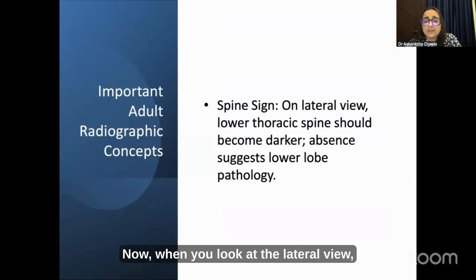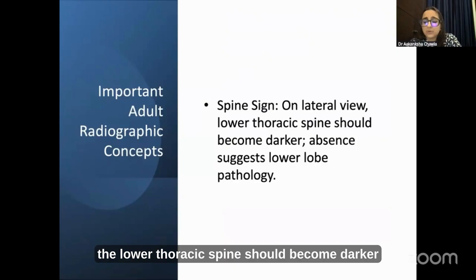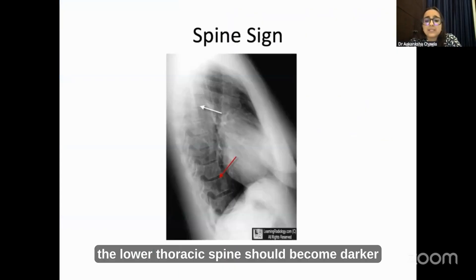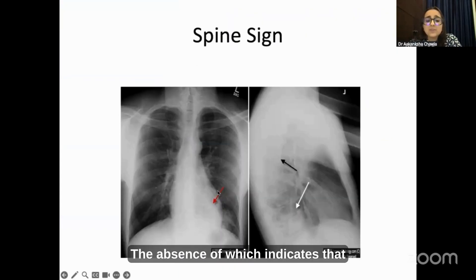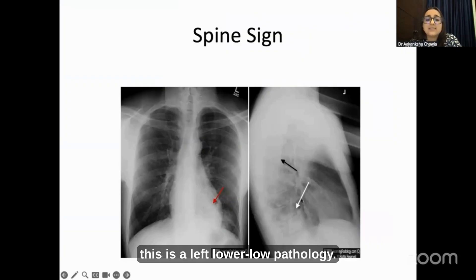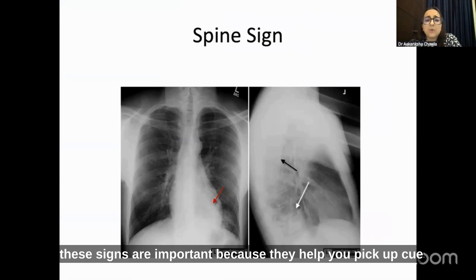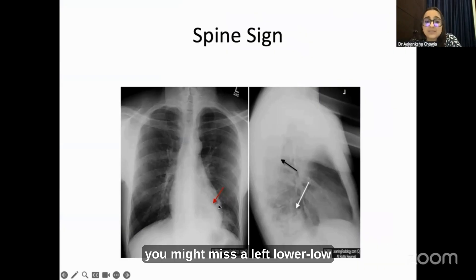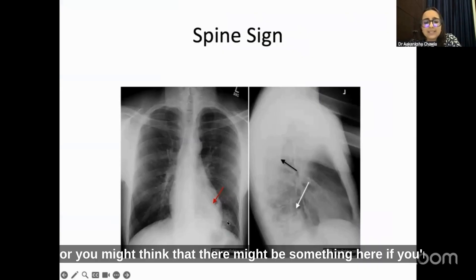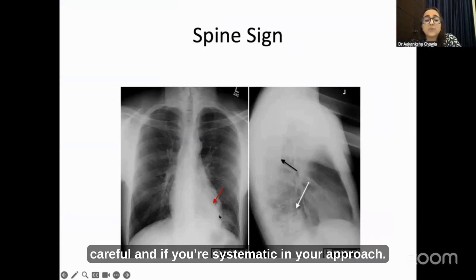There is also the spine sign. When you look at the lateral view, the lower thoracic spine should become darker. The absence of this darkening indicates left lower lobe pathology. These signs are important because they help you pick up cues. If you are in a hurry, you might miss a left lower lobe pathology if you are not careful and systematic in your approach.